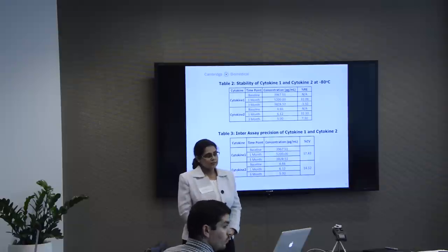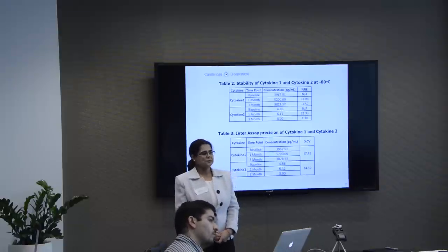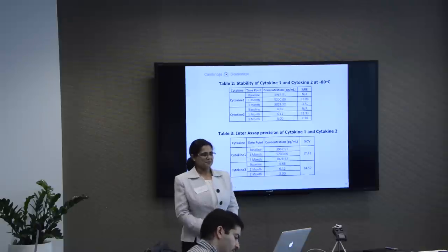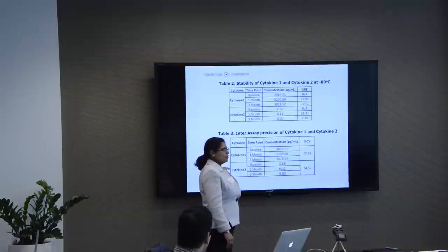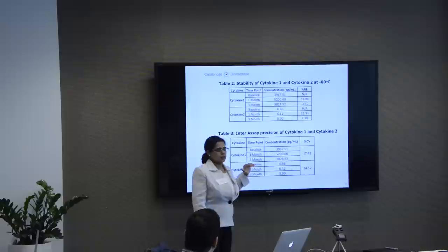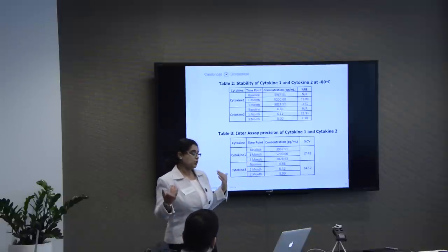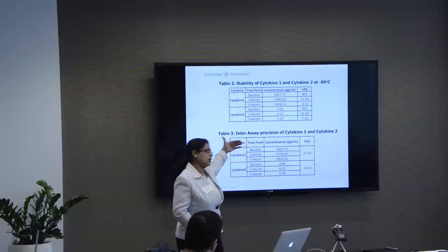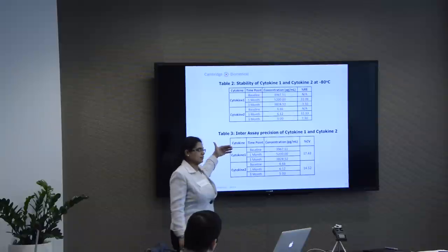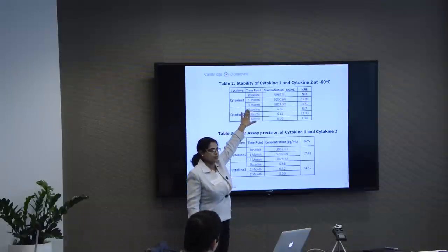So if the kit was different, if the standard curve varied from the initial baseline, do you factor that in? This is why one of the recommendations we always give the kit manufacturer is that they should keep lot-to-lot variation to a minimum. These studies were done with a single lot. So this is a single lot, and you can still see the variability.